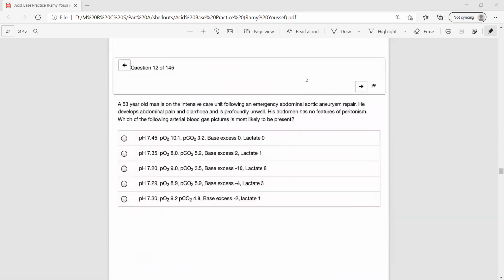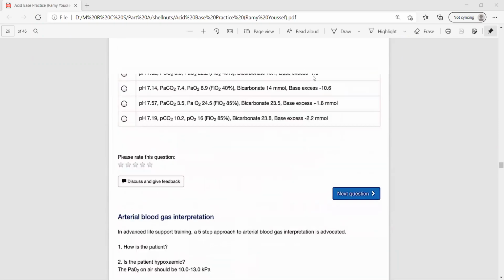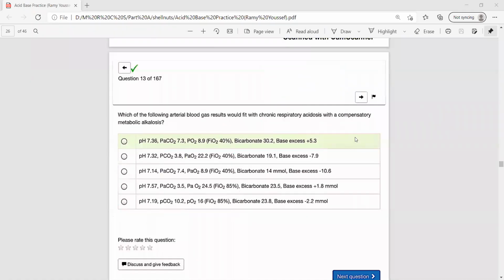I need you to take another one. Sir, please go back to the previous question. That means in chronic respiratory acidosis, pH will always be normal, and you will find it just close to the acidotic condition.